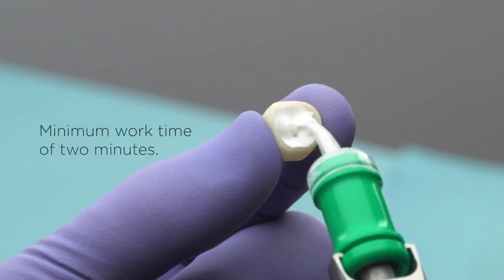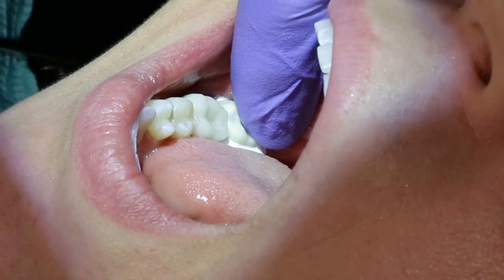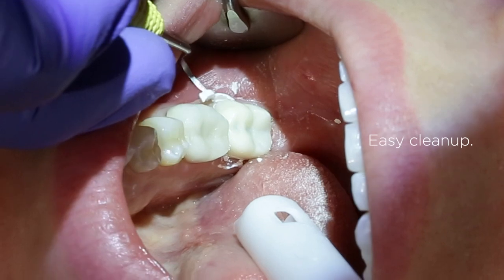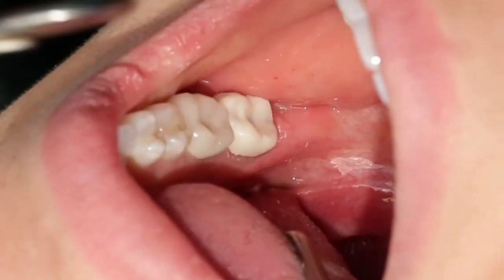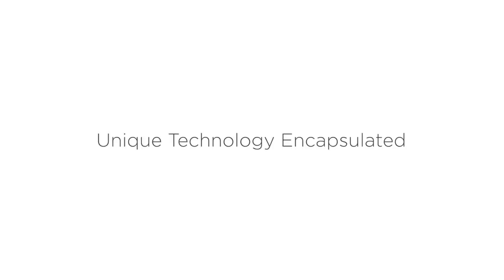Calibra Bio Cement offers a minimum work time of 2 minutes. Seat the restoration and stabilize under pressure until the cement reaches a rubber-like consistency. Approximately 2 minutes after seating the crown, easily remove any excess material. After stabilizing for an additional 4 minutes, the crown cementation procedure is complete.